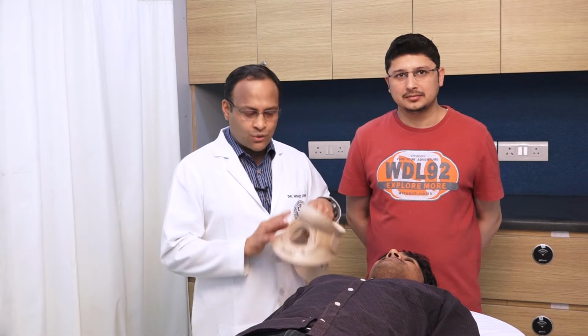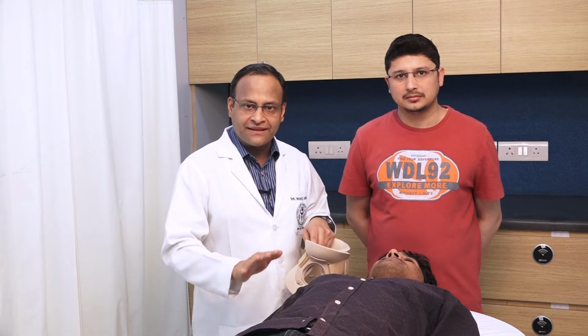So now I'll demonstrate how to apply the cervical collar, and for helping me in this demonstration, we have Dr. Surya and Dr. Ankit with me. Now what I will do is measure the distance between the lower jaw of the patient and the upper part of the shoulder, and this is nearly, you see here, like 5 fingers. So I will select a cervical collar in which the height of the collar is nearly 5 fingers like this. So this will be an appropriate size collar for this patient.